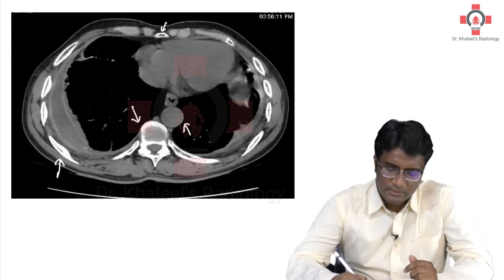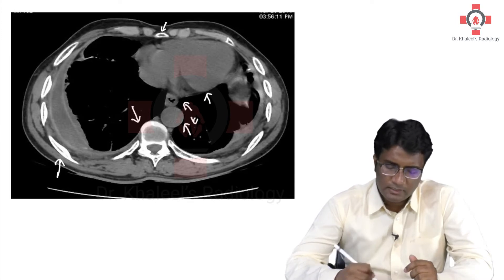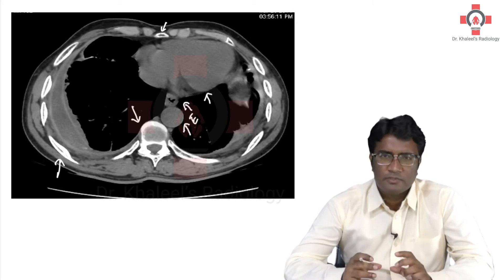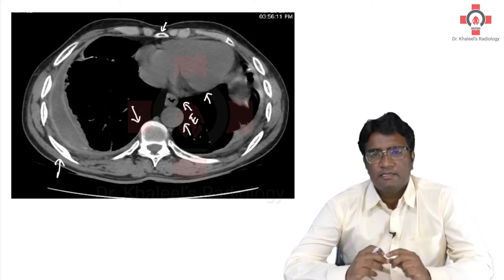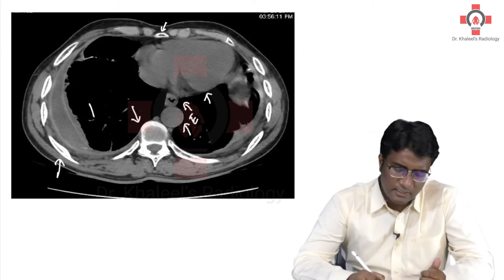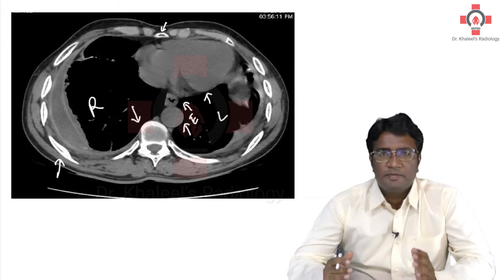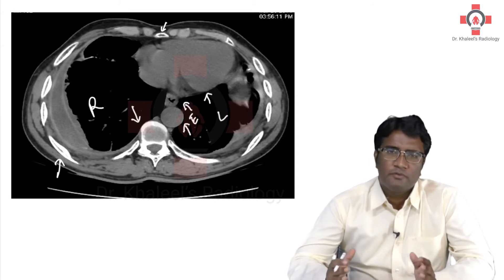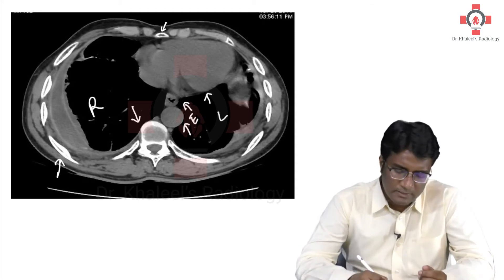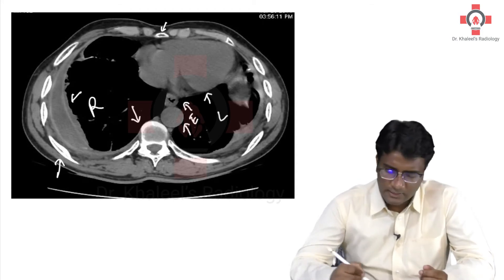This is the descending aorta, this is the esophagus, and this is the heart. Remember, the trachea bifurcates above the heart. So the lucency — the structure which is having luminal air inside — this is your esophagus. You can see this is your right lung and this is your left lung. Remember, the patient is lying down with his legs facing you, so do not get confused between right and left. In the right pleural space, you are seeing some collection.